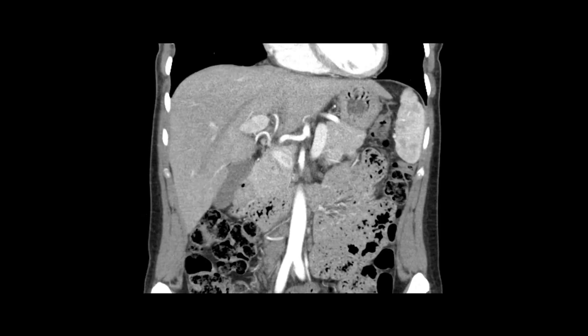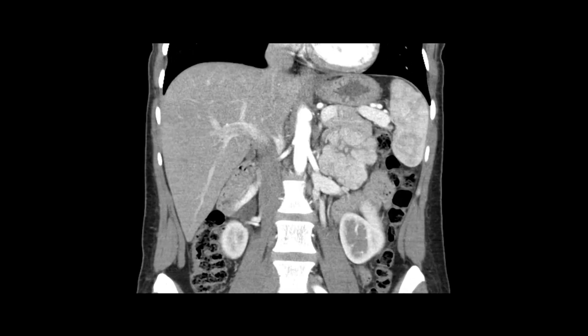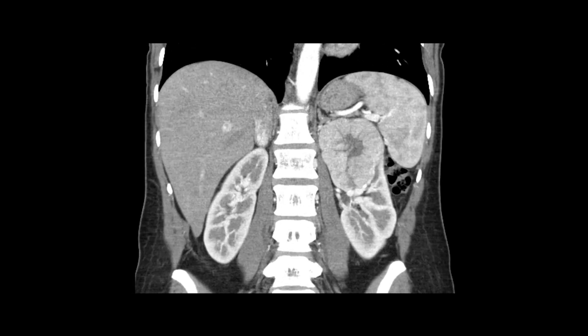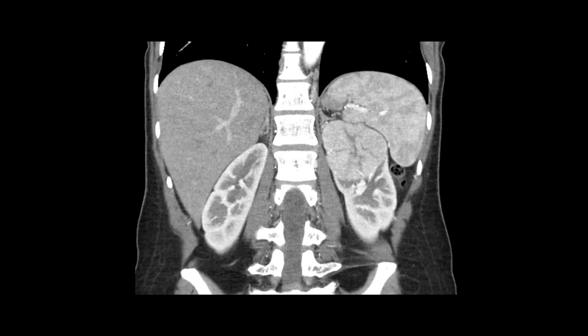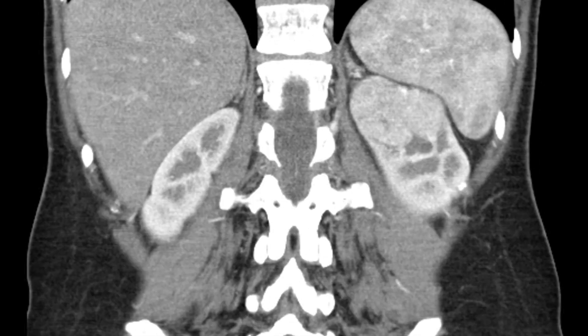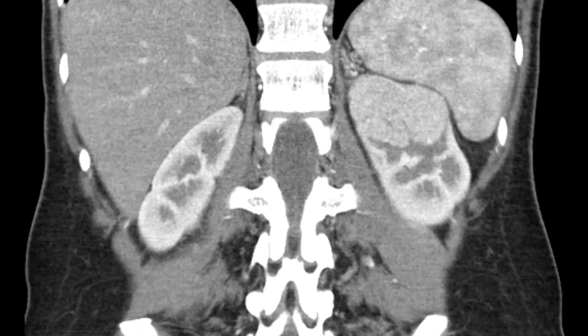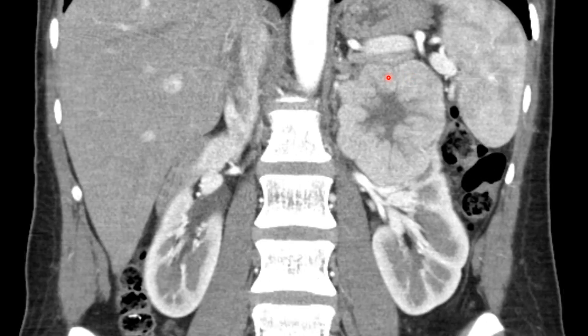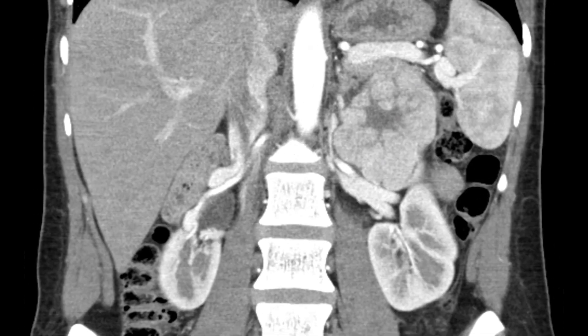These coronal reformatted images from the same series nicely show the enhancing mass of the kidney with the non-enhancing central scar. You can also identify little feeding vessels here, indicating that the mass is quite vascular.